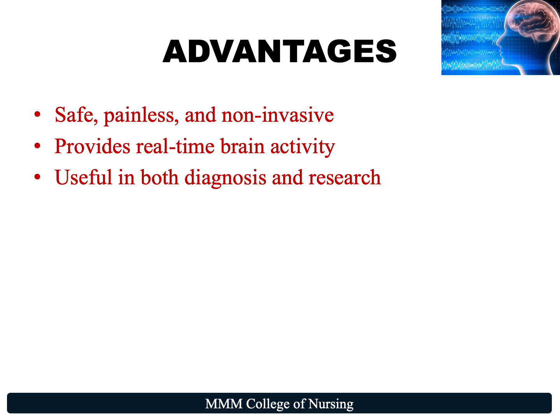Let's look at the advantages. EEG is a safe, painless, and non-invasive procedure. It provides real-time brain activity. This is useful in both diagnosis as well as research.